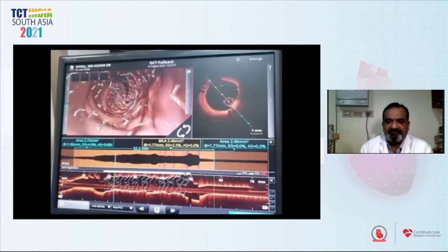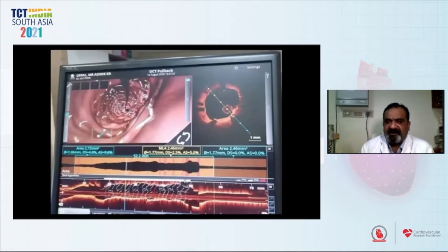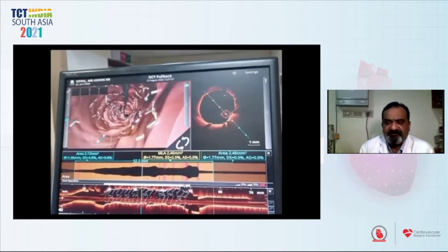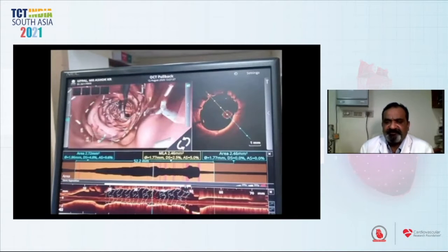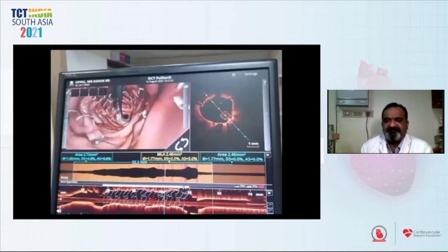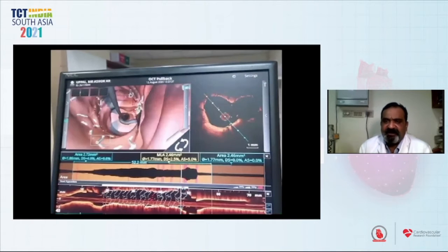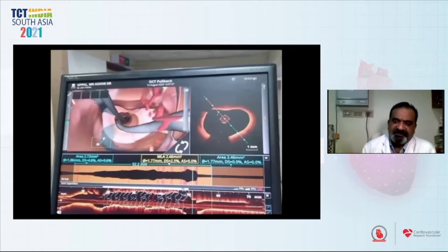This is a 3D reconstruction image of the OCT run. In the terminal part of the stent there was some malapposition — as you can see, three struts were overhanging — so we optimized that with a 4.0 balloon. This is an OCT run from the LAD to the left main. The basic thing was to see if we had missed the left main. In the terminal portion, we can see one strut covering and there was no injury to the left main.